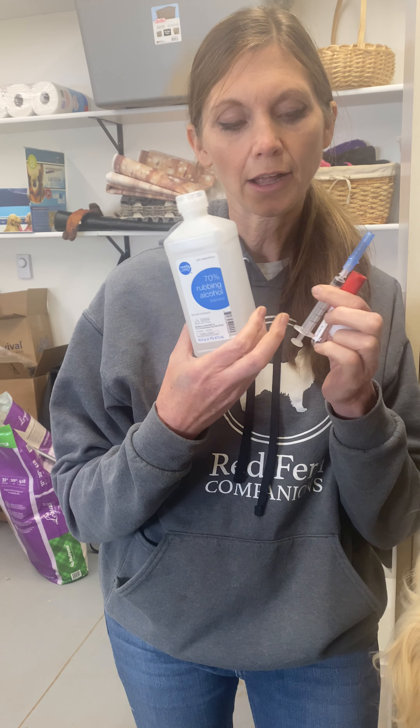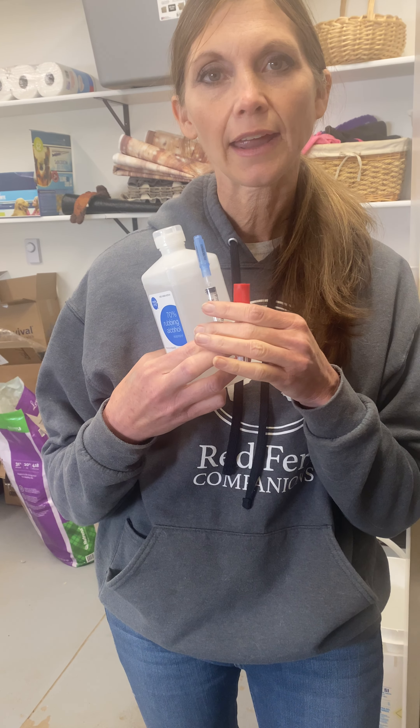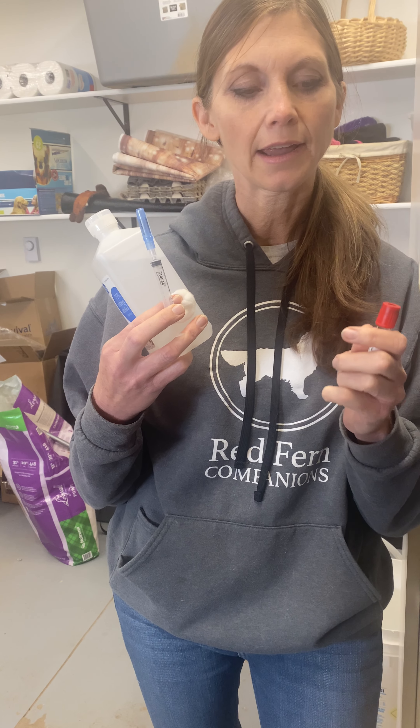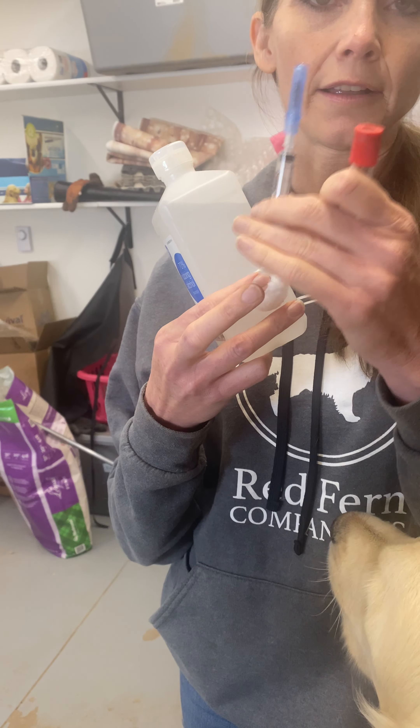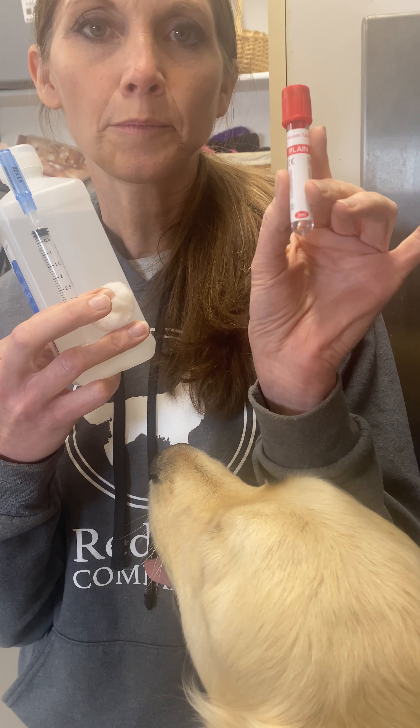Things you're going to need are alcohol and a cotton ball — that's just to clean the area and get the hair to lay down — and a syringe. I'm using a 22-gauge needle, and also a blood tube that will keep your blood fresh.